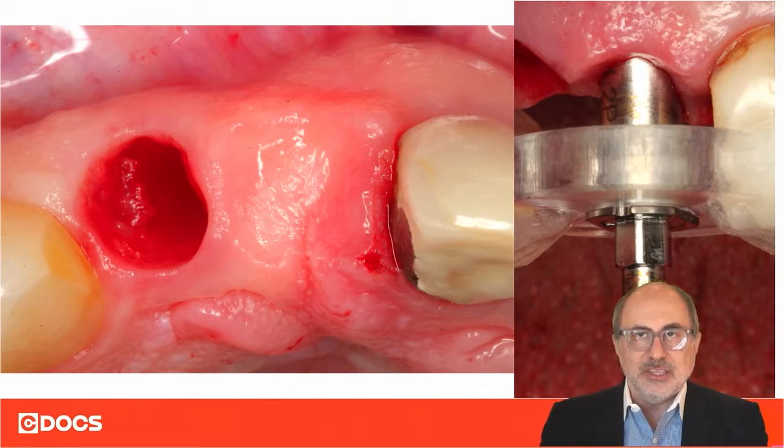The guided drivers for the profile implant don't have an indication of how to position the slope correctly to the buccal aspect. So when we place the implants fully guided with the appropriate driver, we do not know exactly where the slope is ending up.